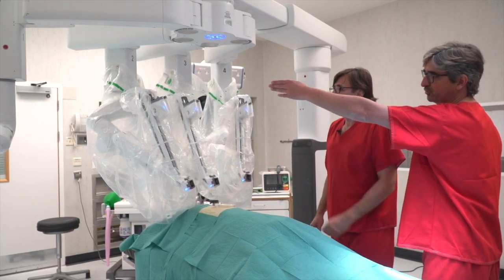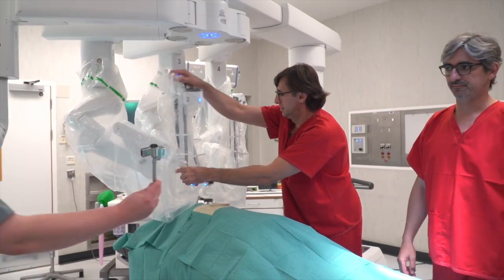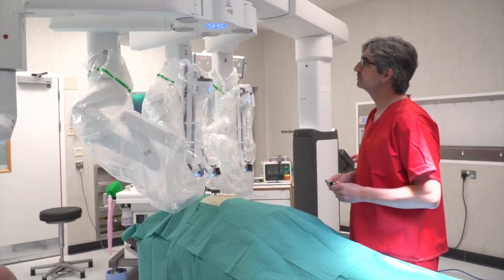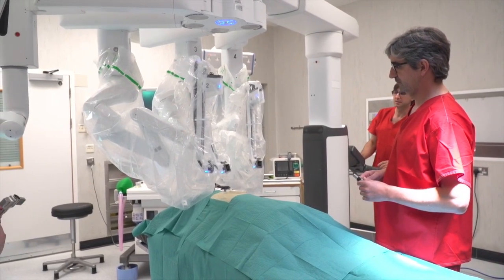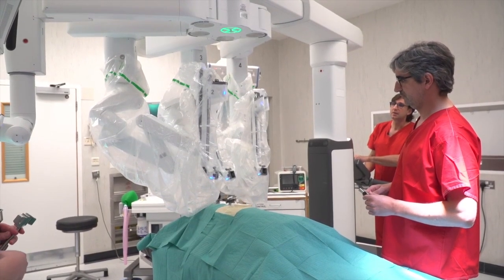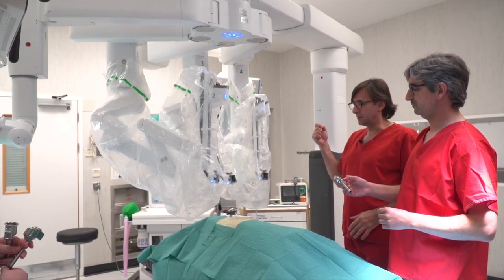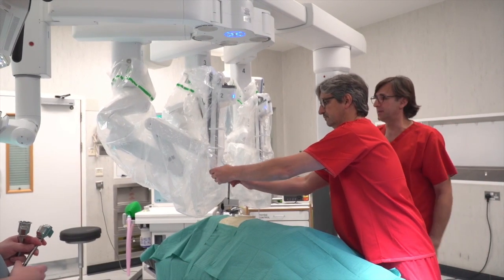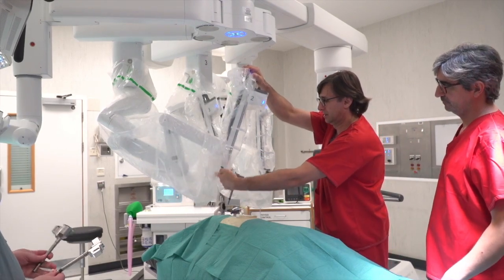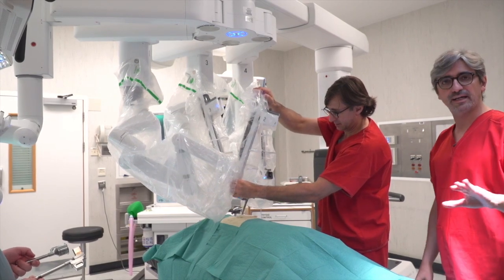Now we use arm two for the robot, for the camera. Arm two for the camera. Have the trocars. Maybe a little boom height. Let's enable joystick. Because for the staplings, when I take out the stapler, there must be some space. Install and filter targeting — no, no targeting. We don't do targeting. It's one of the things that makes this faster.